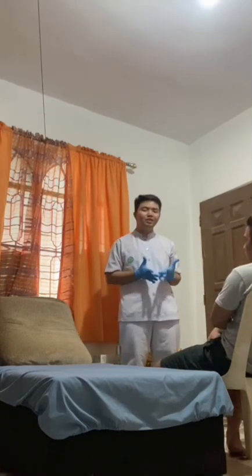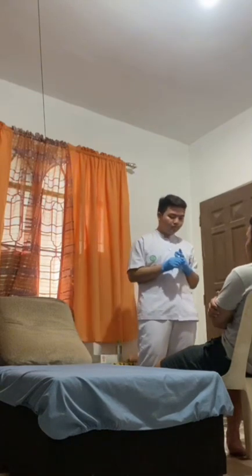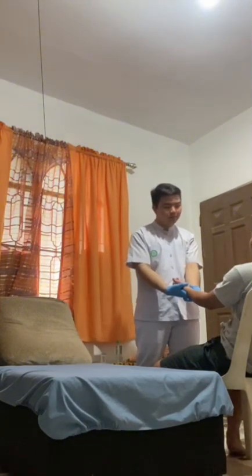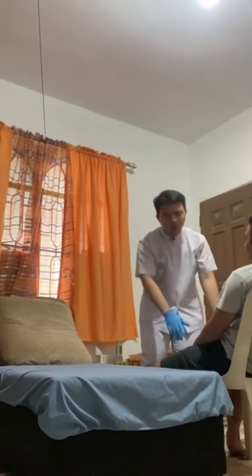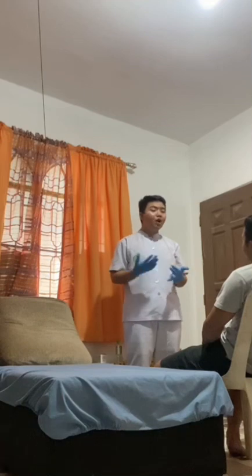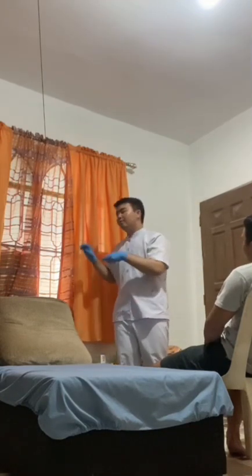And next, I'm going to identify the patient, explain the procedure to the patient, and close curtains for privacy. So, good morning, sir. I'm Caliber Musnir, student nurse for today. May I check your wristband? Can you state your name, sir? And your date of birth? So, sir, the purpose of transferring you from chair to bed is for you to rest and be comfortable. And now I'm going to close curtains for privacy.